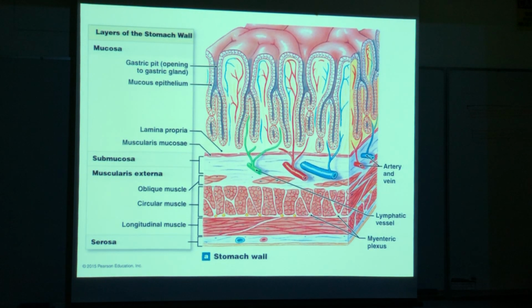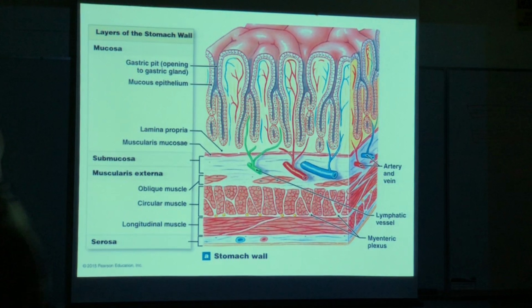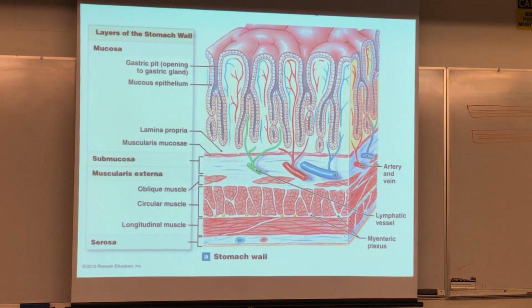All right, with that, we can look at a cartoon that represents our digestive stomach area. What you just saw on camera were those rugae, the longitudinal folds. It's a fold of tissue that creates little pits called gastric pits. At the base of all the gastric pits are glands that contain our chief cells, parietal cells, G cells, and D cells.